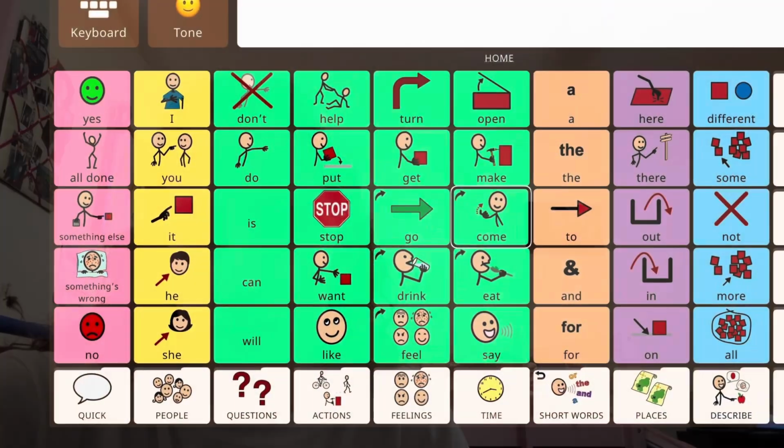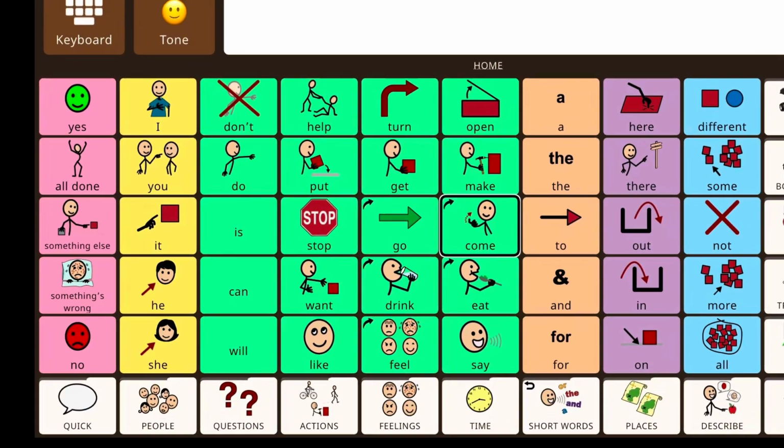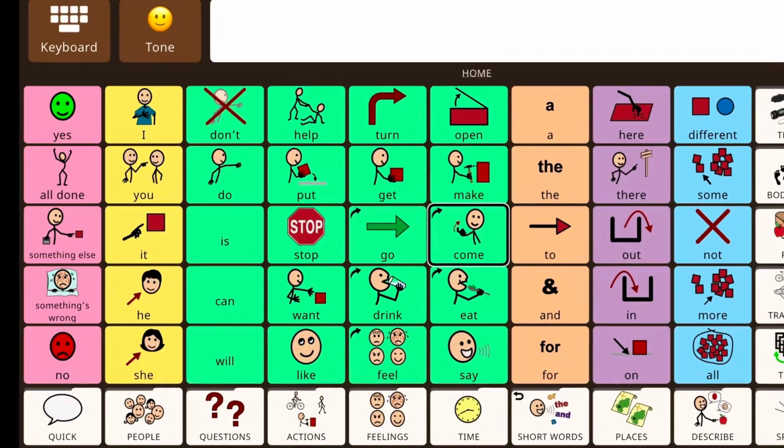So, before I start, no, I cannot take screenshots on the BrailleSense of the app, but I do have the exact same program on my phone as I do on the BrailleSense. So, I will insert a picture right here of what the app on my BrailleSense looks like. So, as you can see, that is an extremely large vocabulary, and that is just on one screen.